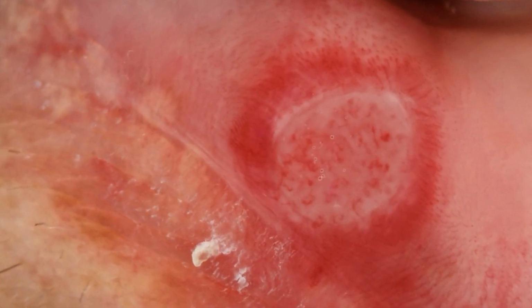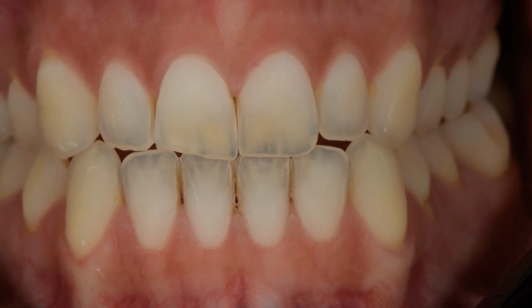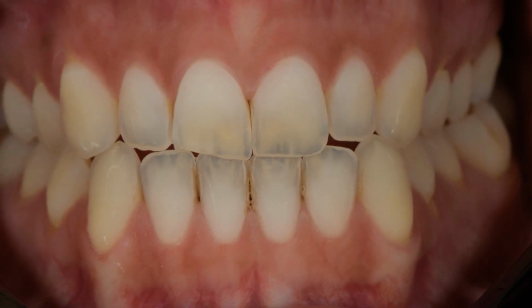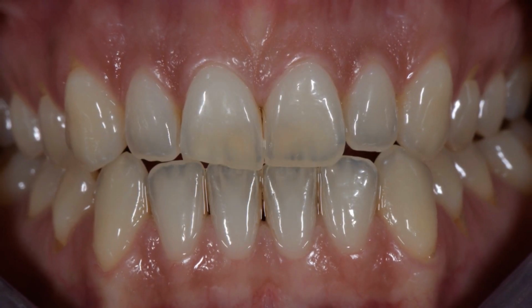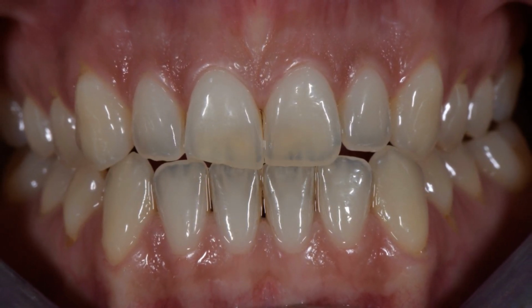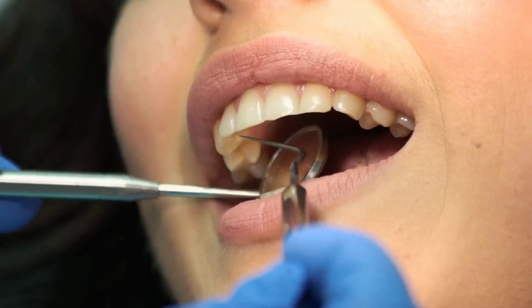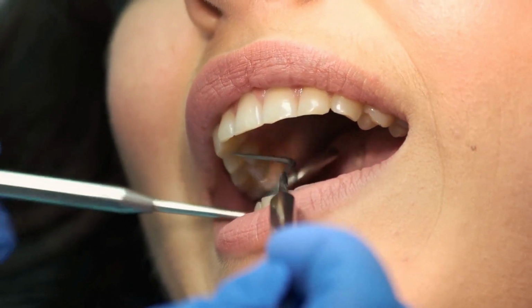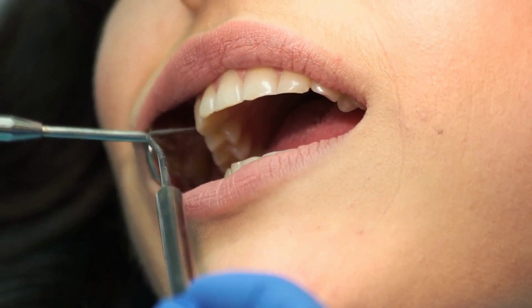In dentistry, cross-polarized photography has emerged as a game-changer, providing dentists with a powerful tool for diagnosis, treatment planning, and patient education. Traditional dental photography often struggles with the challenge of capturing clear, detailed images of teeth and oral tissues. The highly reflective nature of enamel, combined with the presence of saliva and other fluids in the mouth, can result in images marred by glare and obscuring reflections.